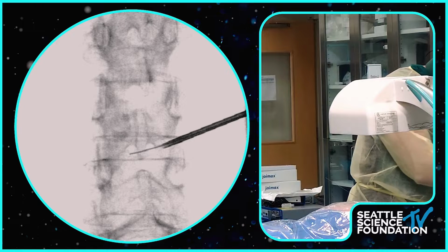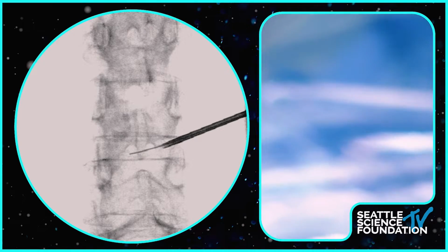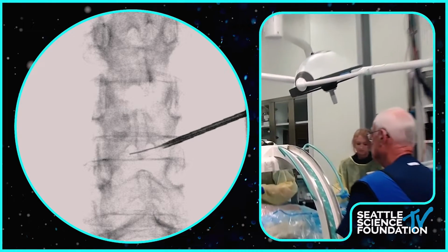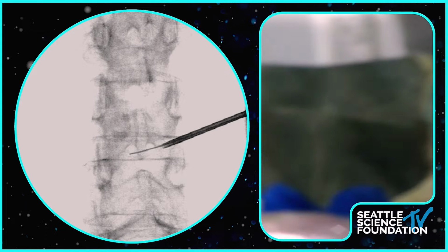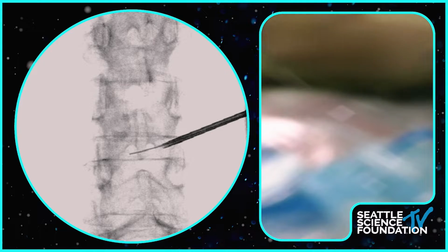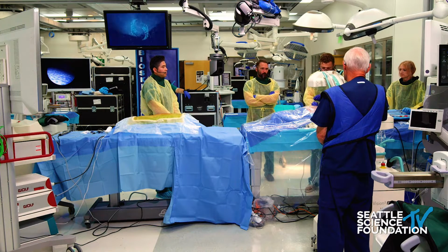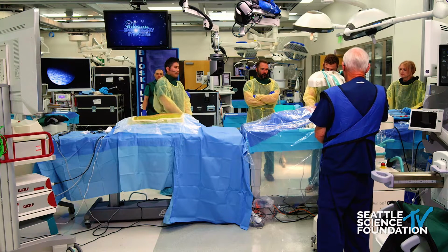So what we'll do first is just put in all our dilators in here. Thank you. There are multiple different systems of how to do this. Like I said, I'm just going to go all the way. It goes green, and then yellow, and then red. And between each color, there is a reamer that matches that. Okay.